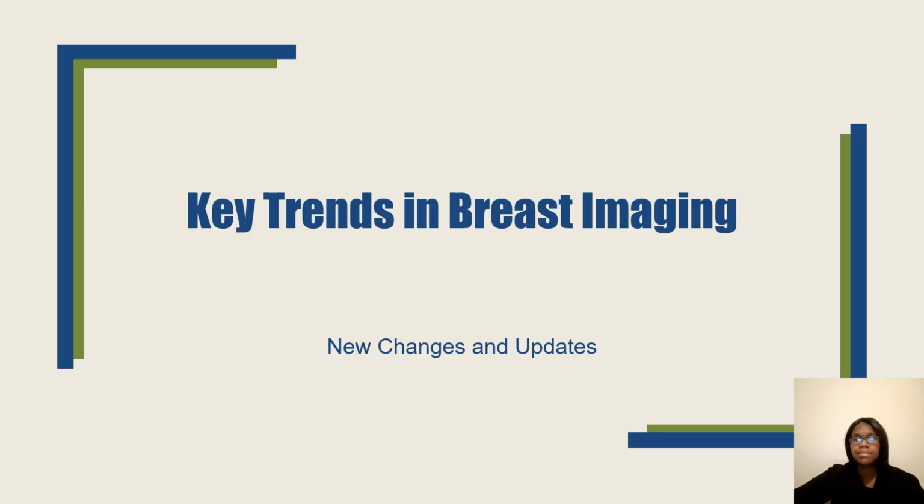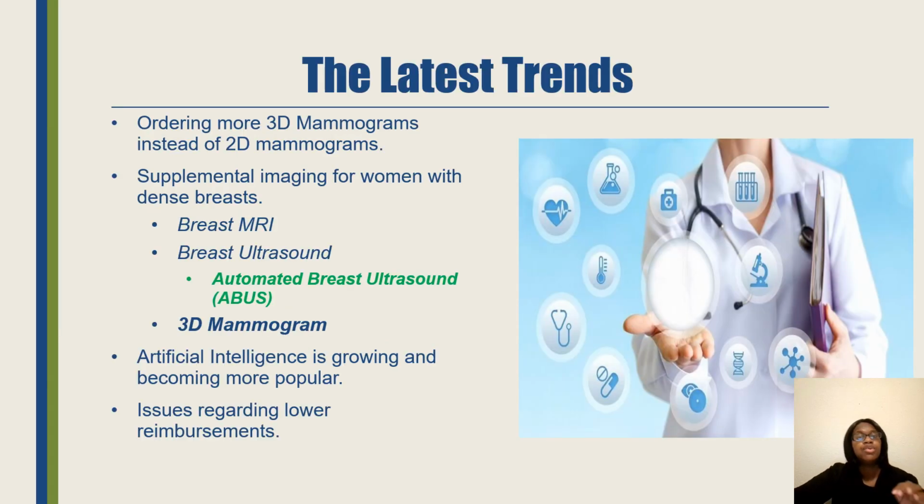Now we're going to talk about the key trends in breast imaging when it comes to new changes and updates. For the latest trend, you also have 3D mammograms being mainly performed, and then you have those supplemental imaging like a breast MRI, a breast ultrasound, 3D mammogram. AI is growing. It's very popular now. A lot of people are talking about it. A lot of people are using it.